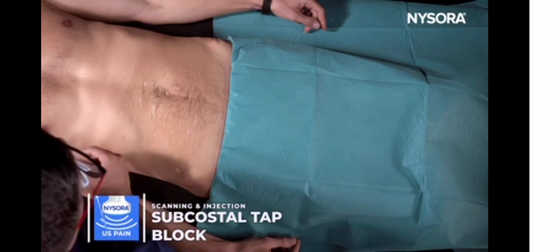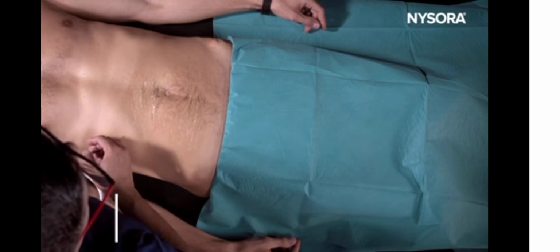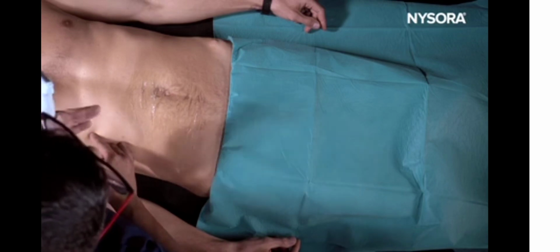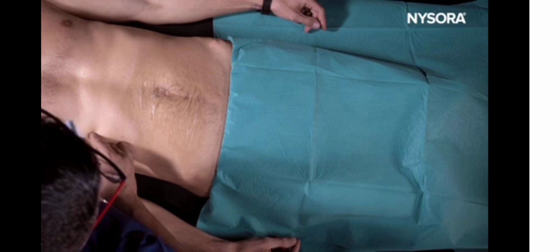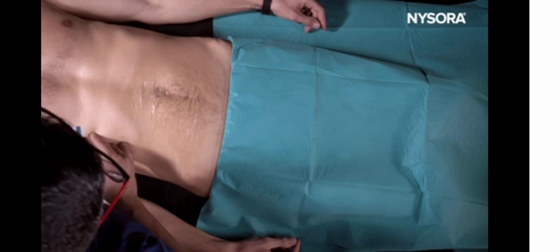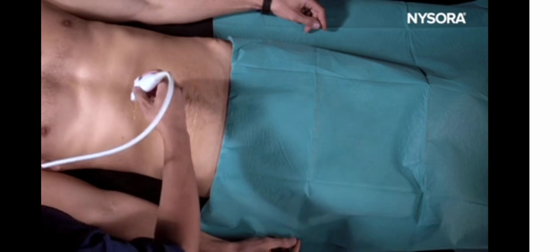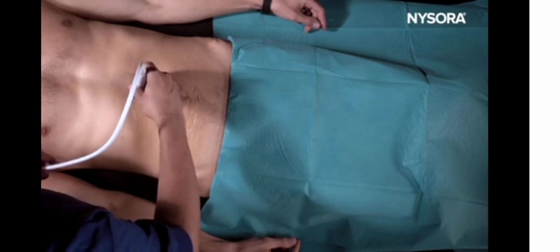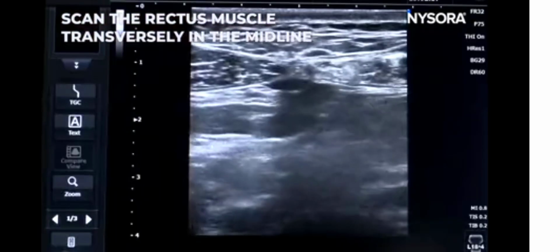The subcostal TAP plane block for chronic pain is useful when you have patients who've had post-cholecystectomy pain syndrome, or they've had an abdominal surgery and they have a chronic post-surgical pain syndrome. You could use this for abdominal myofascial pain syndrome as well. To perform the subcostal TAP block, the structure you will start to scan, this would be the midline, looking for the rectus muscle.